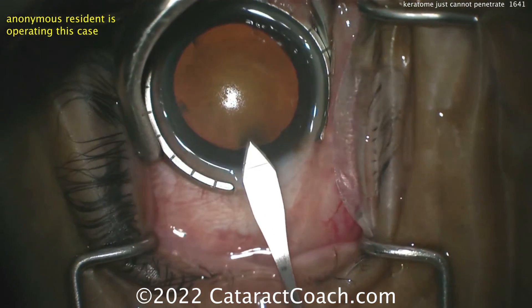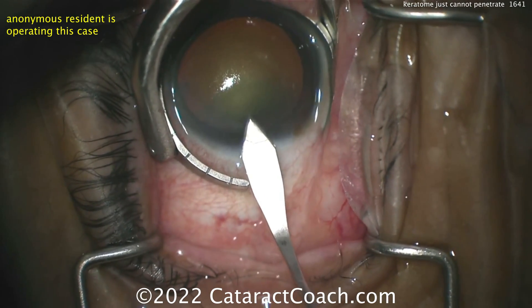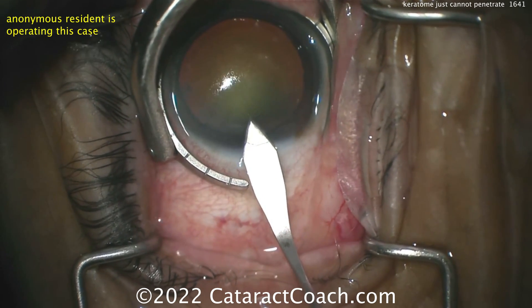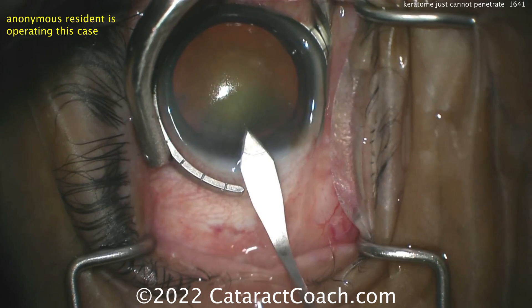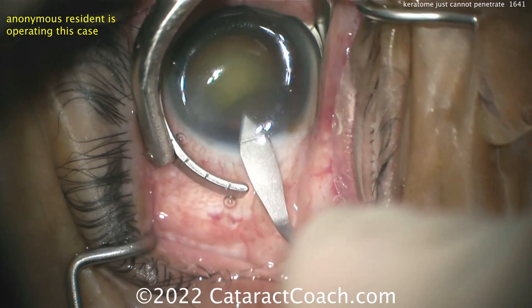That looks pretty good. But let's try one more time to penetrate here — pushing, pushing, pushing. And again the fixation ring is slipping away. What do you do now? Do you try to use forceps to hold the eye? Do you hook the paracentesis with a chopper or something? What are you going to do here to get that keratome in the eye? It just doesn't want to go.